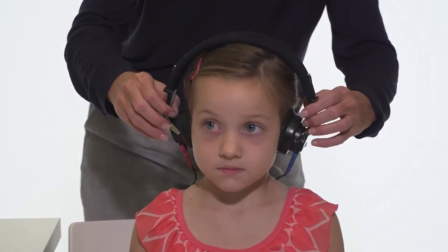With a refer result, best practice is to re-screen immediately, preferably by a different tester and with a different audiometer, including removing the headphones from the child's head and carefully replacing them over the ears.